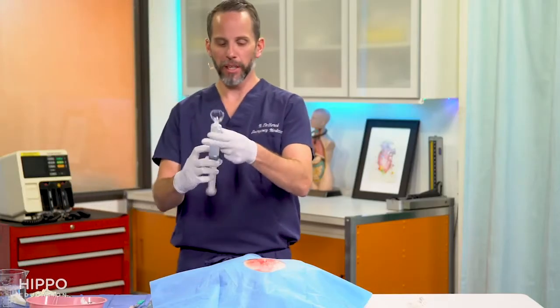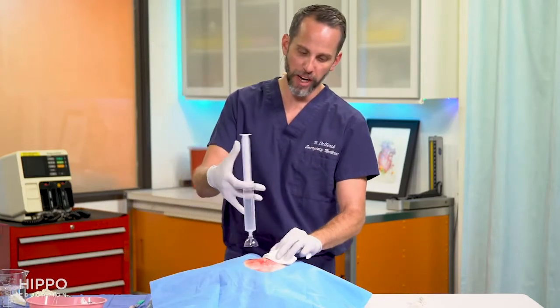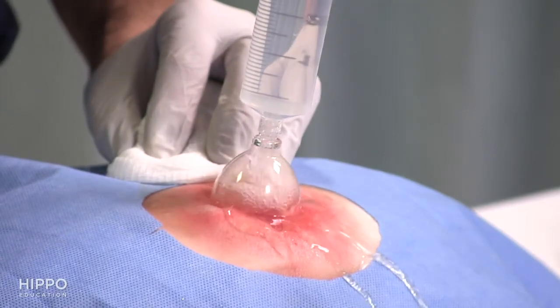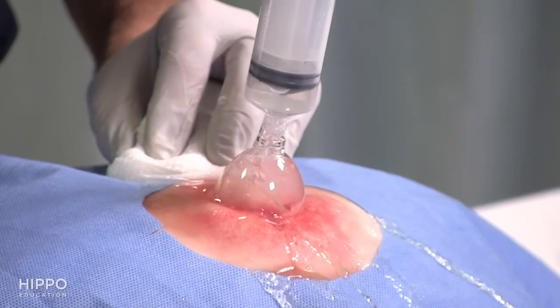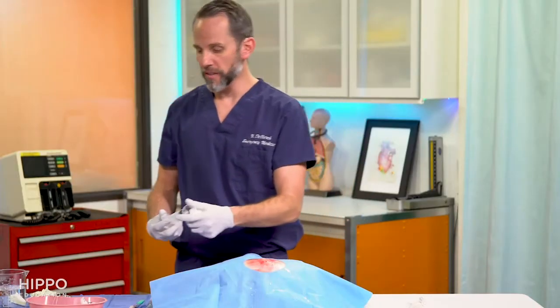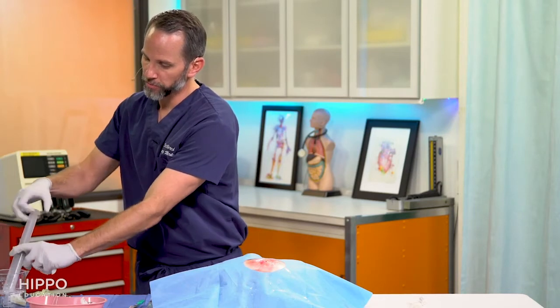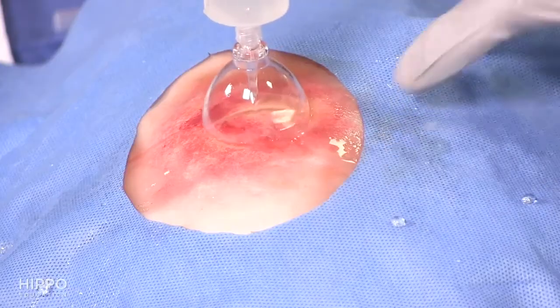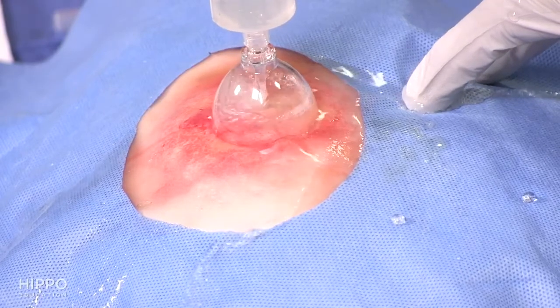You put your protective cap on it. And for this part, I always grab a couple extra 4x4s because the spray can come out. You're basically going to be pressurizing and putting some normal saline in there and clearing it out. You're filling up that abscess. It helps debride all the necrotic tissue. It's going to be pretty messy, so be aware of that. Using some towels down to help pick up some of that water is also useful. And you just basically irrigate it out till what you have coming out is relatively clear and you don't have a whole lot of pus left, and you've done adequate irrigation.